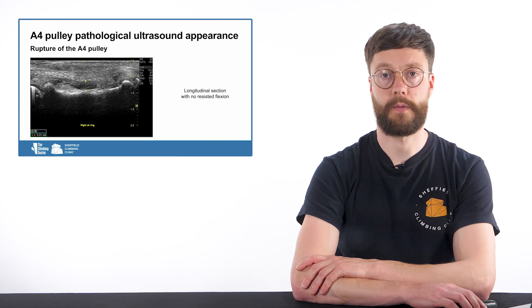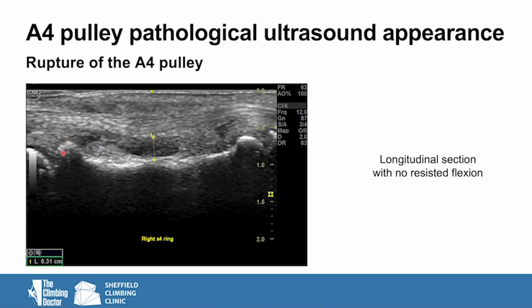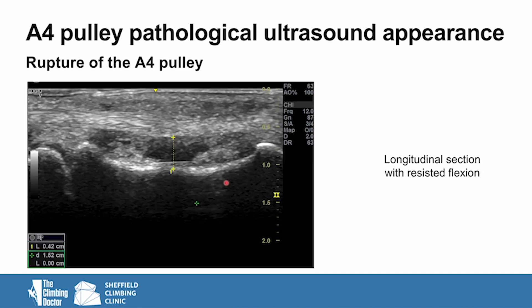Let's take a look at the appearance of a pathological A4 pulley — in this case a rupture. On the image we can see the proximal interphalangeal joint, the bone of the middle phalanx, and the distal interphalangeal joint. Compared to the previous images, we have lost that appearance of the flexor tendons going towards the bone; the tendons are now sitting up in a straight position with a gap between the tendons and the bone of 3.1 millimeters. With resistance added, the distance between the tendon and the bone increases to 4.2 millimeters, which is typically what we would see with a rupture of the A4 pulley.